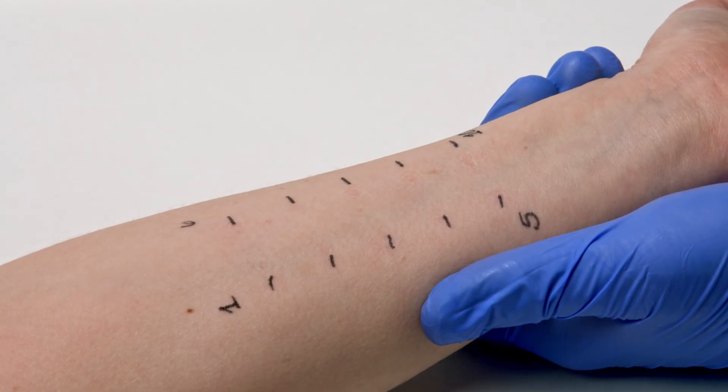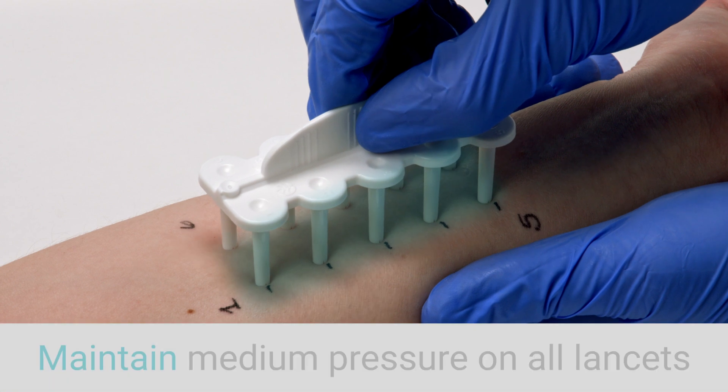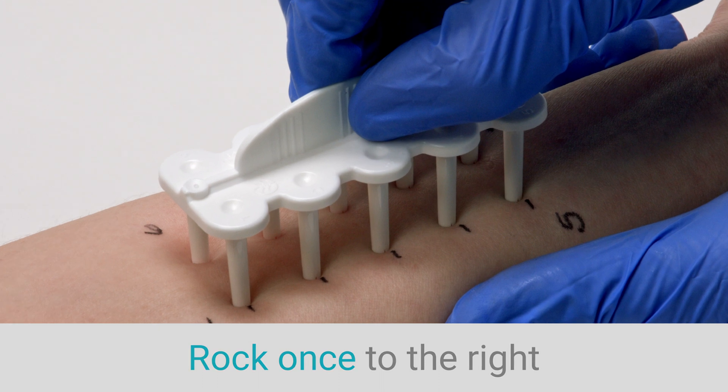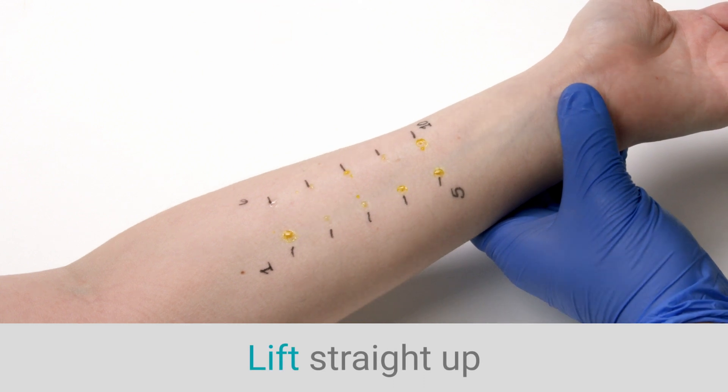With the Comforten device perpendicular to the skin, press down with medium pressure. Maintaining this pressure, slightly tilt the device once to the left and then to the right, while ensuring that all 10 lancets remain in contact with the skin. Remove by lifting vertically.